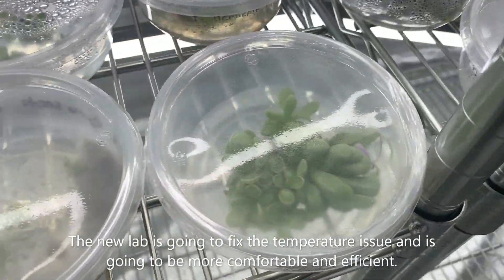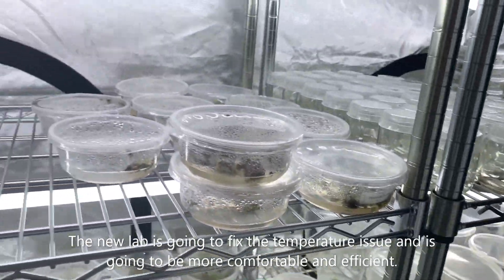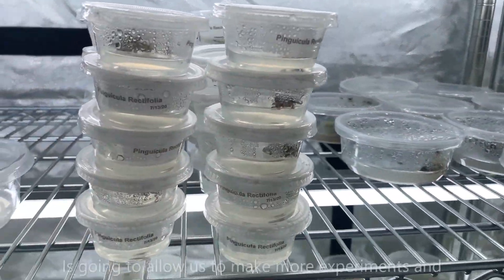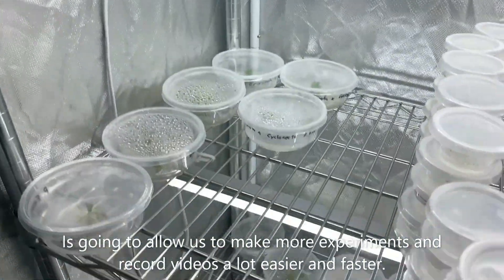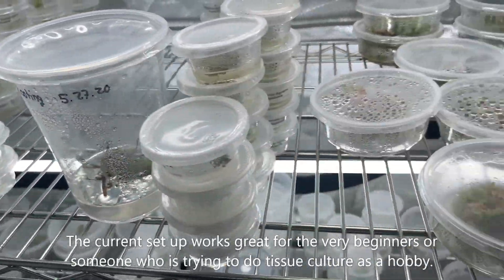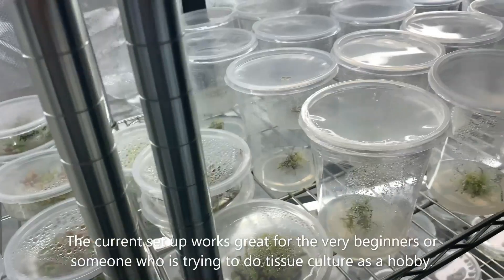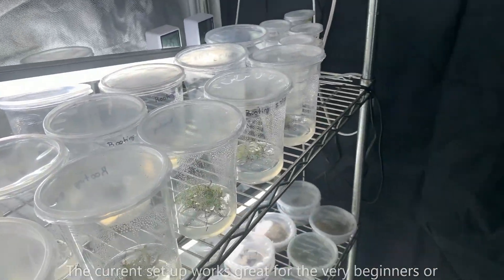There's not really an air conditioner so it gets a little warm sometimes. Our new lab is gonna be able to fix the temperature with an AC unit — it's gonna be a lot more comfortable and efficient, and a lot easier to do experiments and record videos. This grow tent setup is actually perfect for beginners or anyone doing tissue culture as a hobby, but long term not so great.